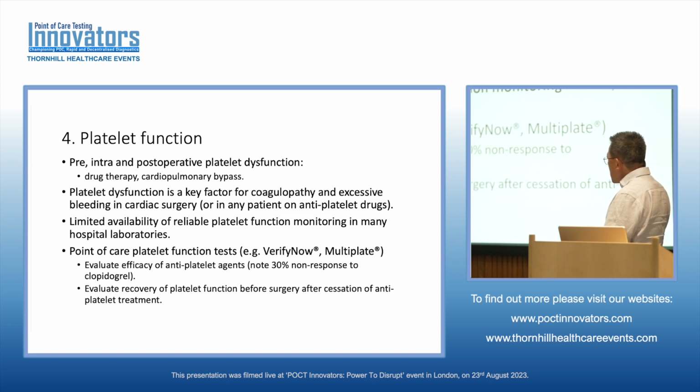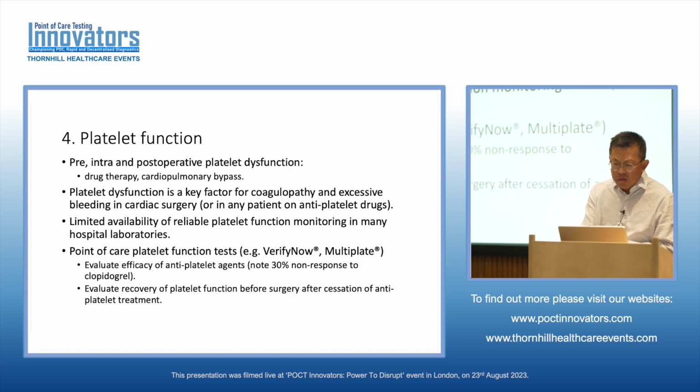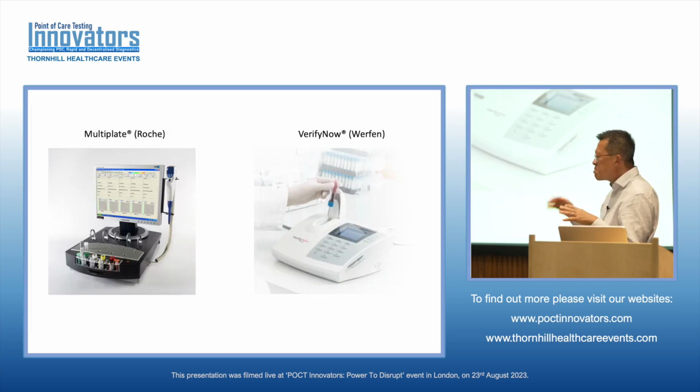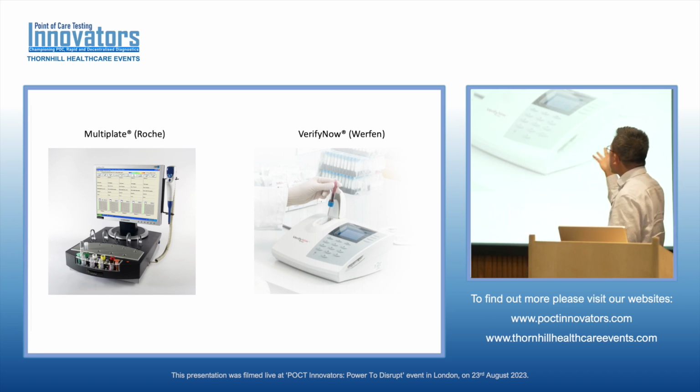Now, is it useful? I think it's useful in specialist areas, possibly. But my colleagues in the non-cardiac surgery unit have a device that gives them a sort of platelet function as well, not Multiplate or VerifyNow, but a different device, which is perhaps not as good as the Multiplate. And they certainly use it quite a lot because they do a lot of vascular surgery and a lot of patients are on antiplatelet agents. So we've been using the Multiplate for nearly 20 years, and we used this briefly, but we don't use it at the moment. The cartridge is much more expensive.